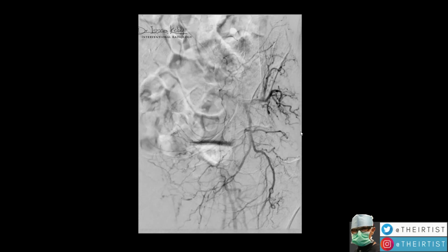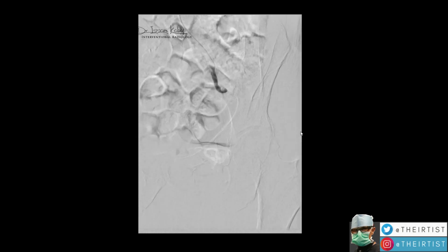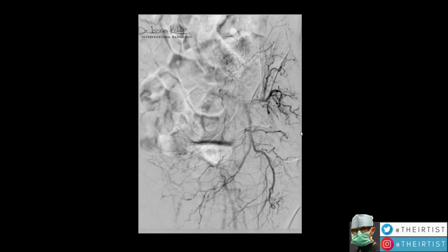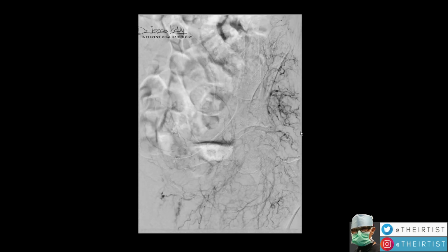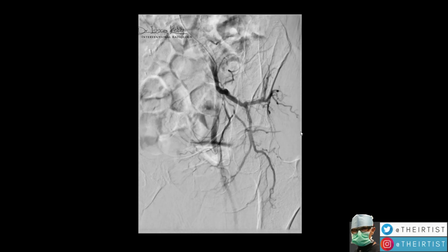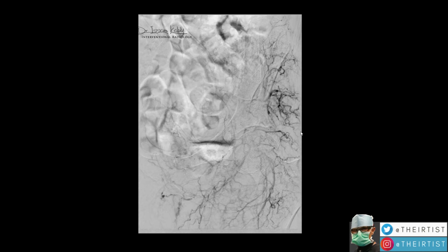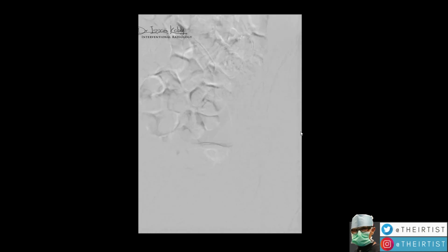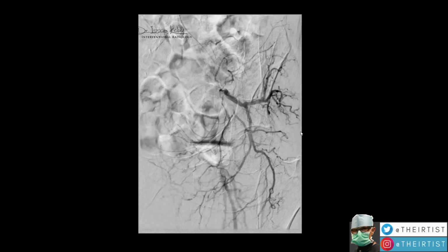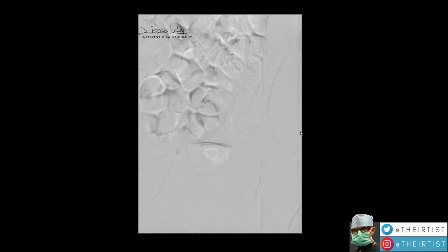So this is the first challenge of PAE, and this is why it's considered one of the most challenging, because it has what I call the cognitive challenge. The challenge means recognizing which artery is which, because everything could potentially be a landmine. You need to recognize there's only one good artery, and we have no right to super selectively go into the wrong one, because that may cause the patient damage. So it's a cognitive challenge.